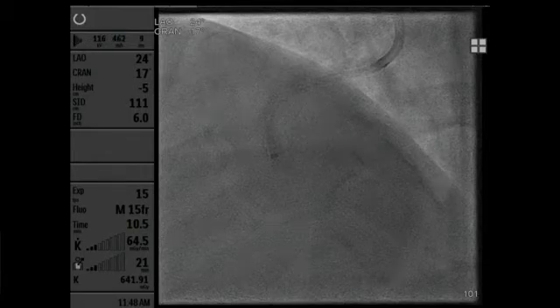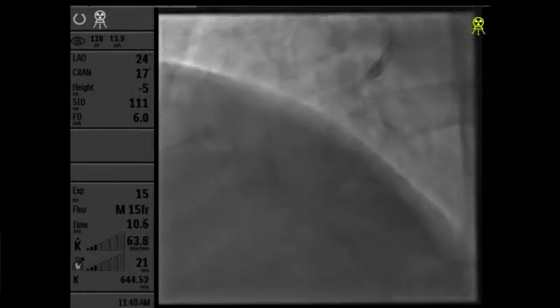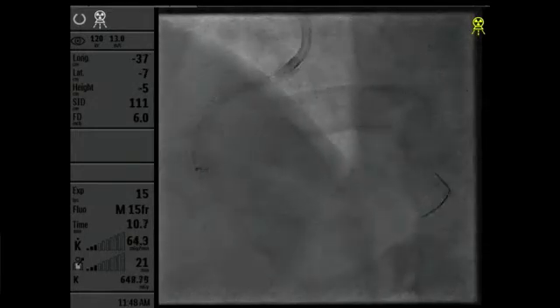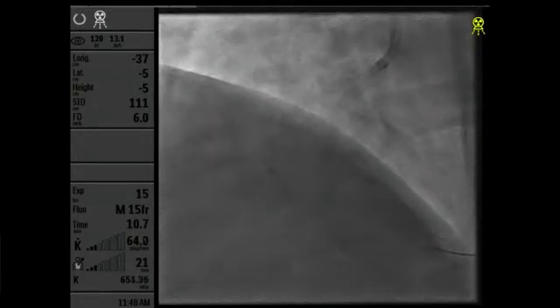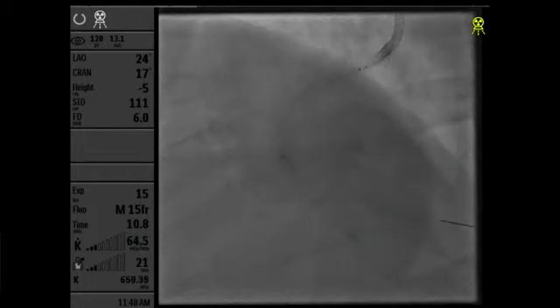So you actually have to apply more shock waves to the eccentric lesions. And I think this will apply to this nodular lesion. So the point I'm making is that you should apply as much energy as you can. I would use up all of the balloon's energy, all 80 shocks, to this whole region. Yeah, I agree with you. Jonathan, I think, is correct.